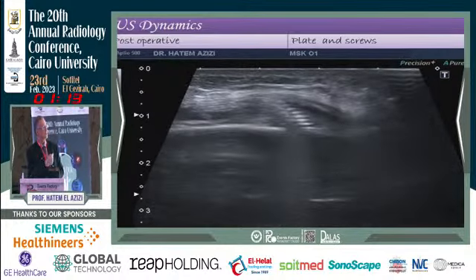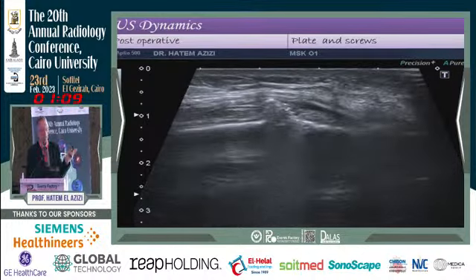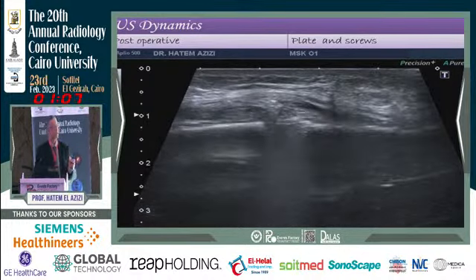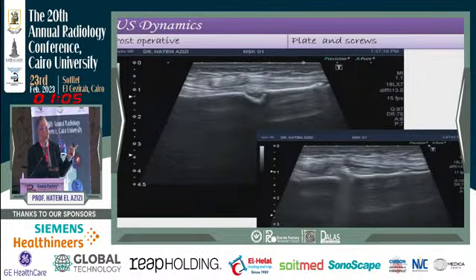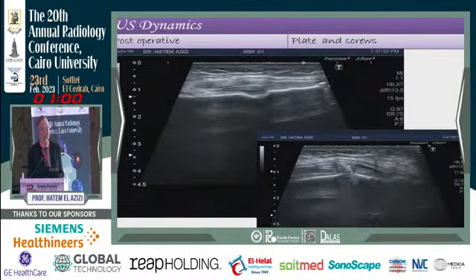During dynamic, we can see sliding friction with the tip of the screw. This is abnormal. This causes the pain. It must be removed. Actually, they removed the screw. You can see the edema and the swelling become less compared to before the operation.